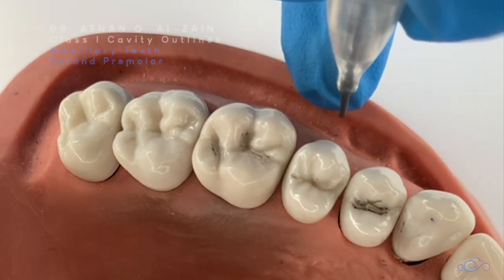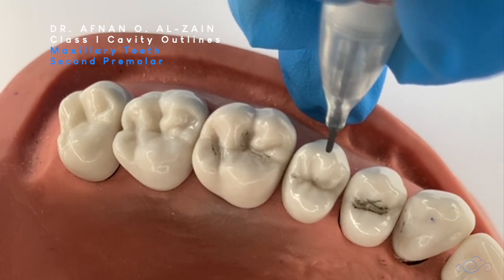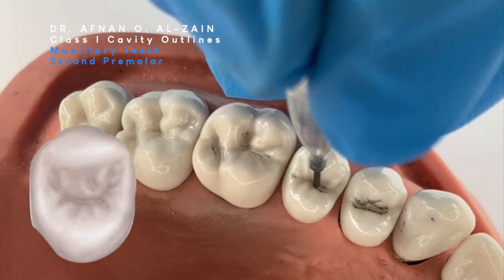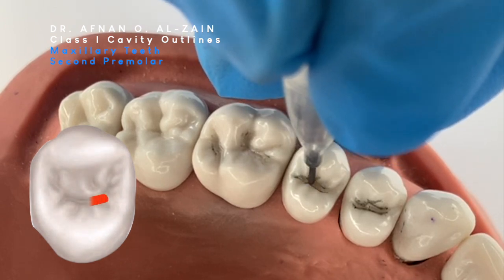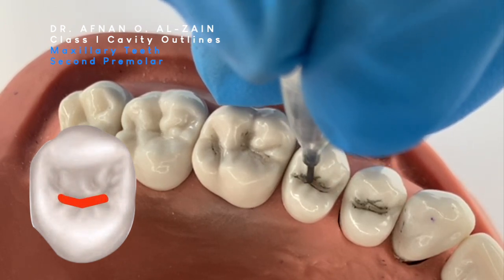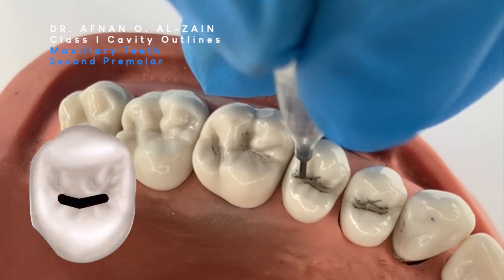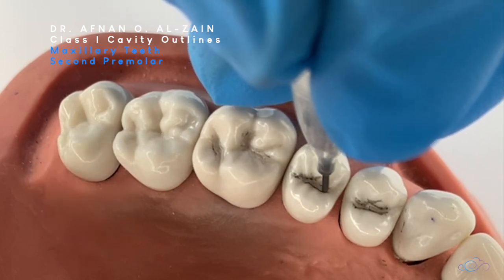Moving on to the second upper premolar. This is very similar to the four — we're going to go from the pit to the pit, or from the fossa to the fossa. It is also a straight line.